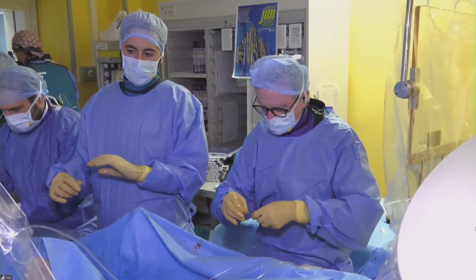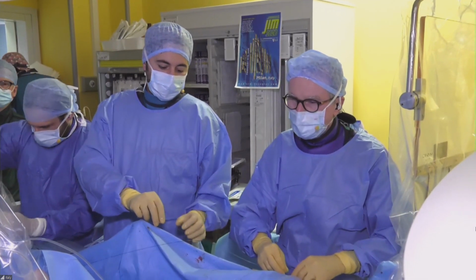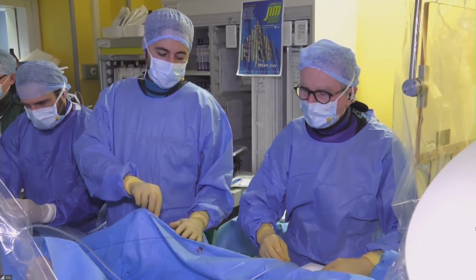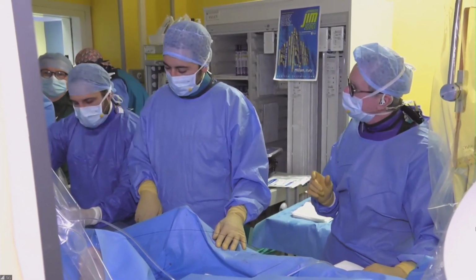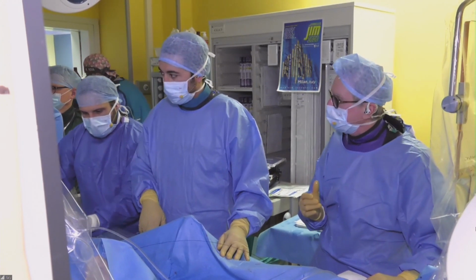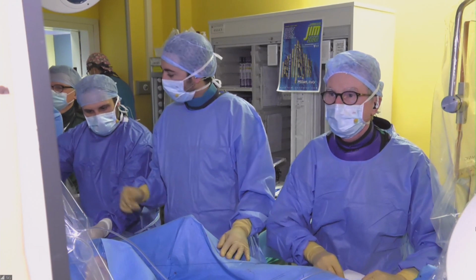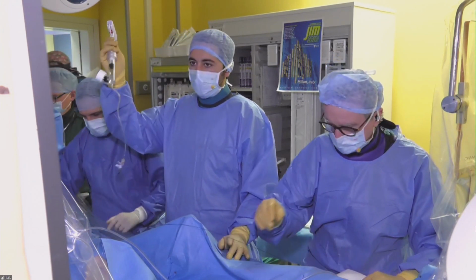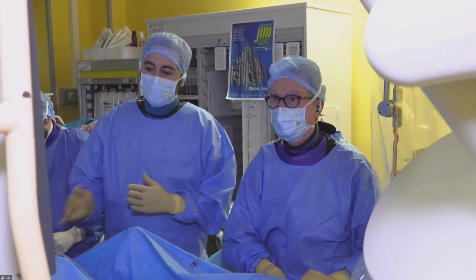So if we can, in the meantime, good work, and in the meantime we go to the other room. And maybe post-dilate with an 8 millimeter semi-compliant balloon at 3.5 to flare the stent a little bit proximally, because I think proximally is really a big vessel. Okay. So can we go to the other room? Yes. Okay, Dr. Antonio Colombo, we are back to you.